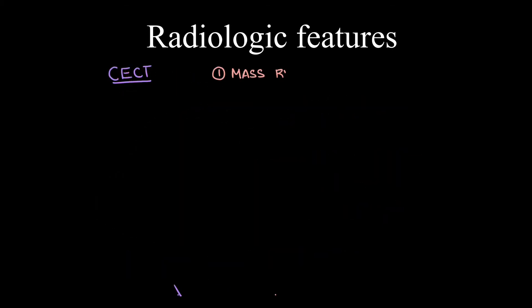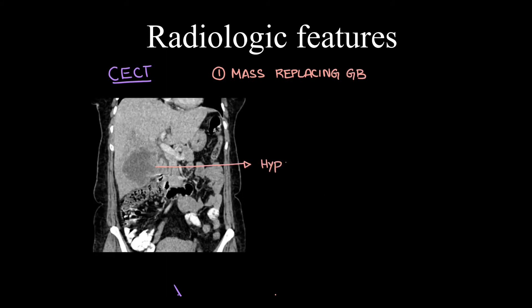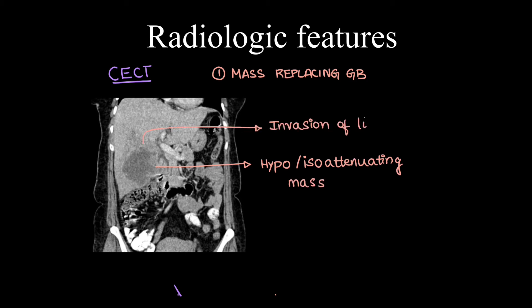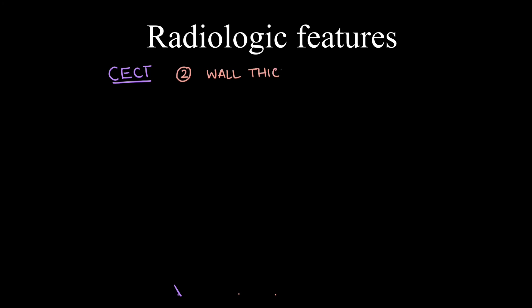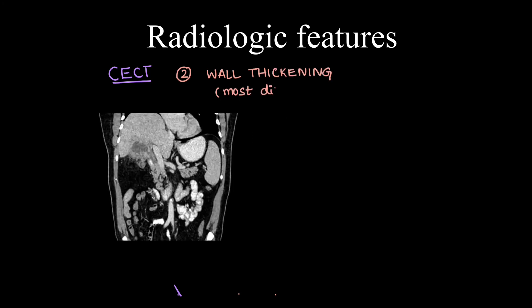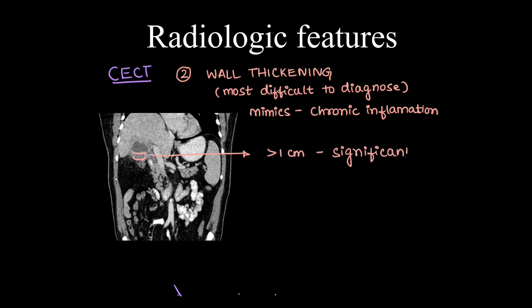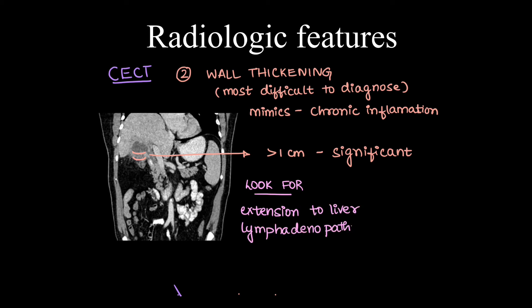On contrast enhanced CT, the first type — mass replacing gallbladder — we already saw a case. This is a similar case where there is a hypo- or isoattenuating mass replacing the gallbladder with ill-defined interface indicating liver invasion and central necrotic areas. Also look for lymph nodes, IHBRD, and liver metastases. The second type can present as wall thickening — wall thickening more than 1 cm is considered significant. Look for extension to liver, lymphadenopathy, and hematogenous spread to other organs.